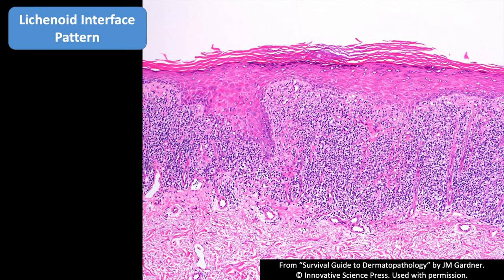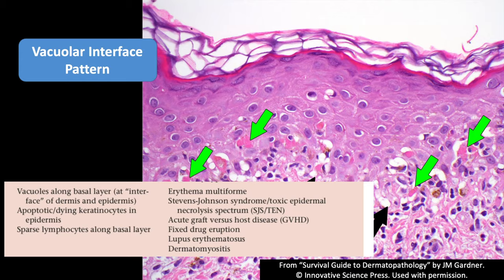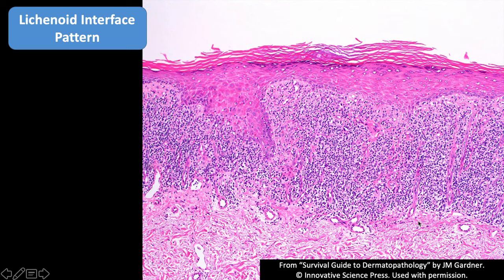Here's an example of lichenoid interface dermatitis. I think of vacuolar and lichenoid as just two ends of the same spectrum. Both have vacuoles, lymphocytes at the basal layer, and dying keratinocytes. The difference is that vacuolar has relatively sparse lymphocytes, while lichenoid has a massive band of lymphocytes forming a thick band right underneath the epidermis.